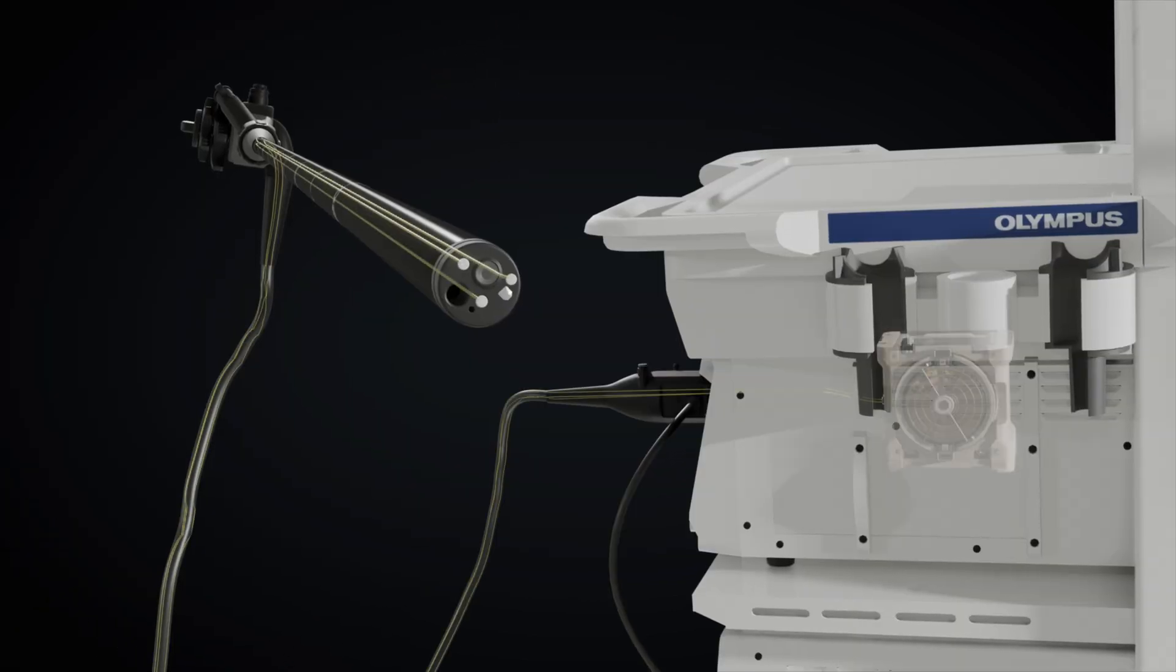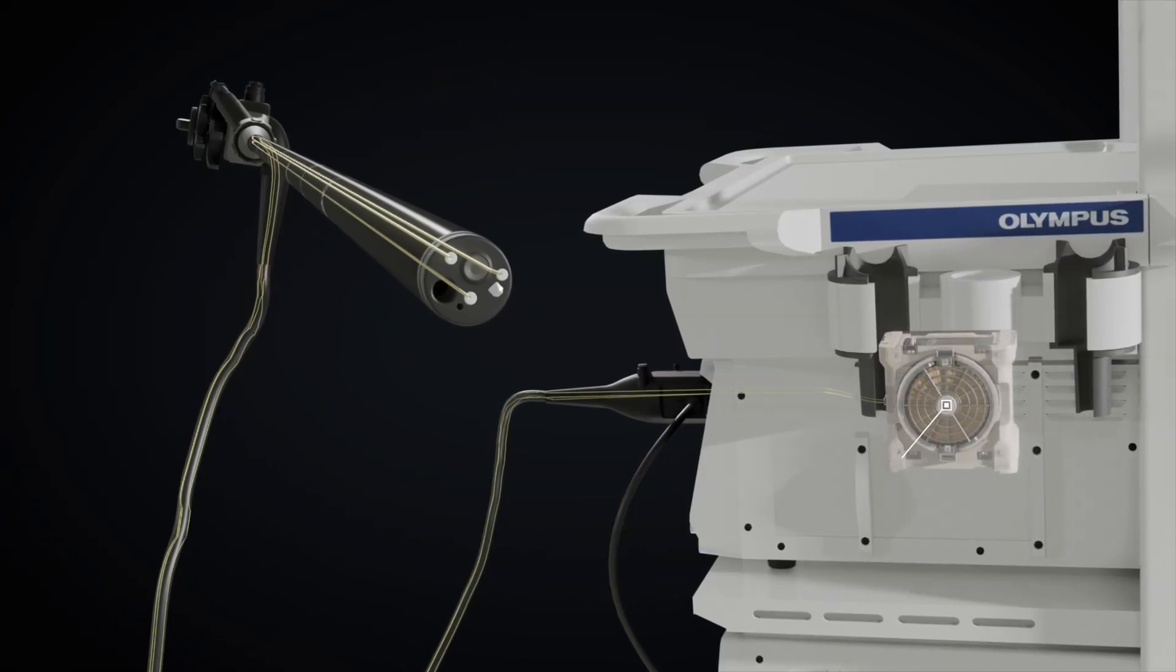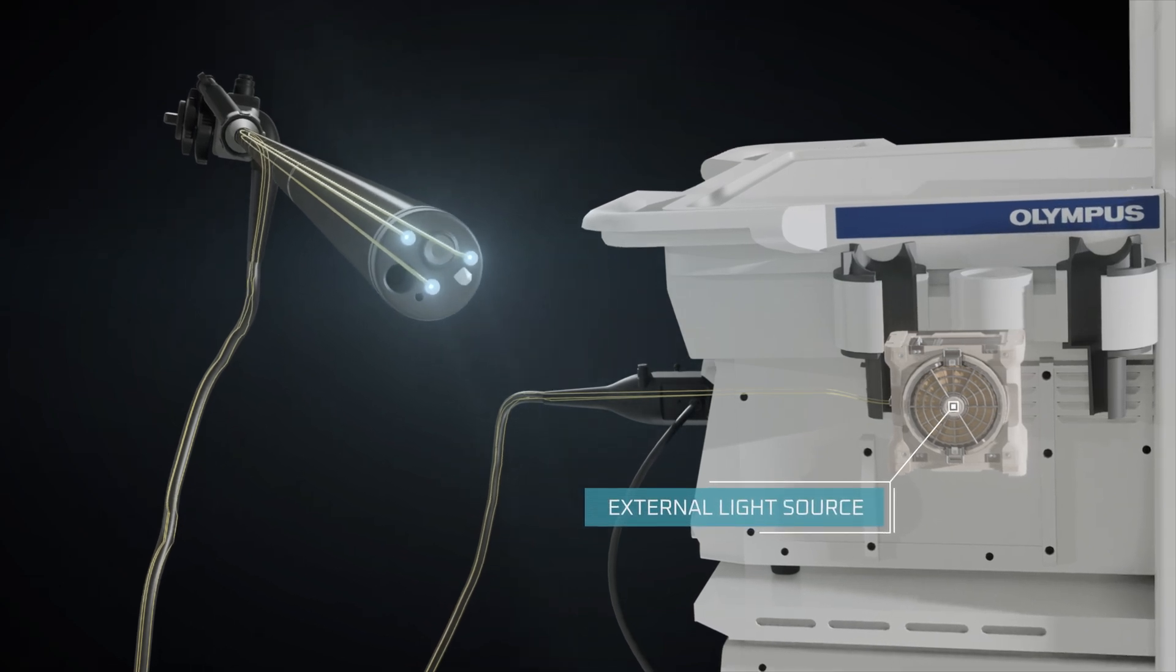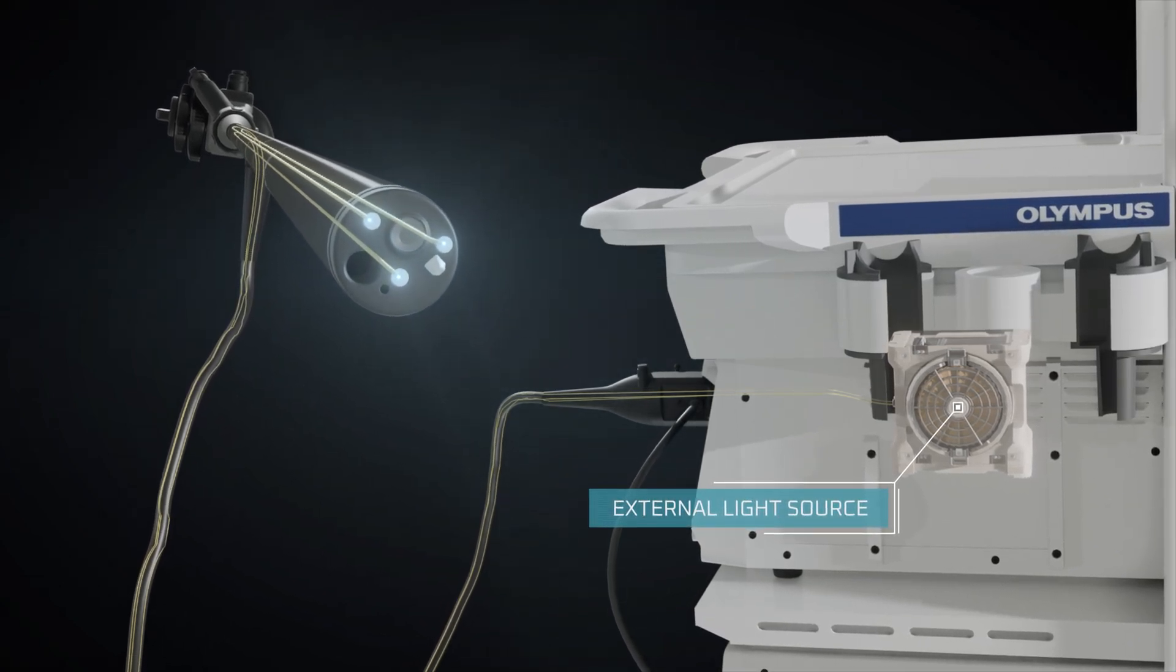Light guide fiber bundles convey external light through the endoscope to illuminate body cavities.